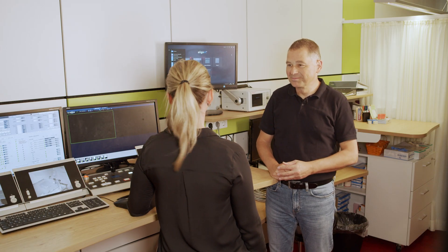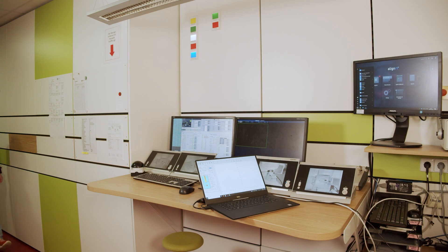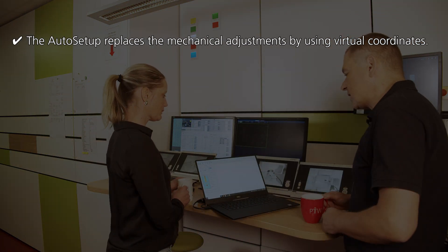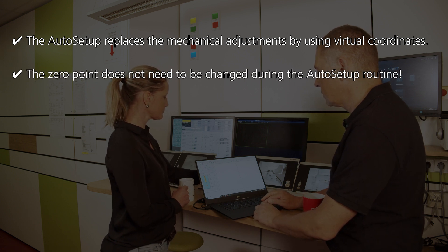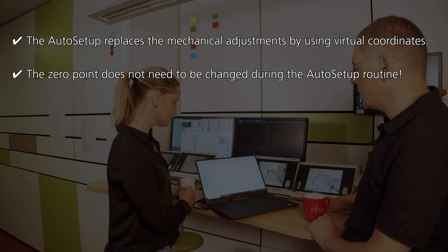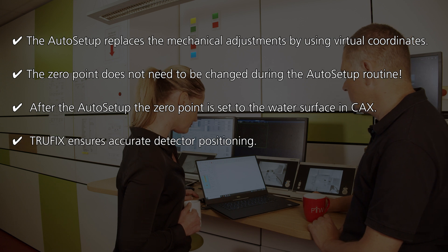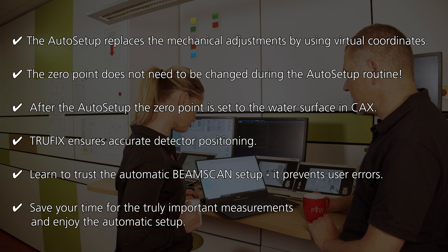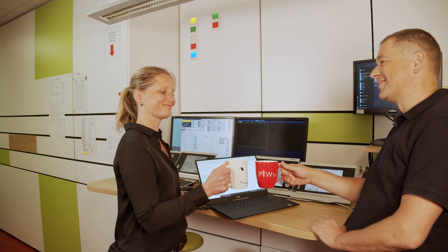Okay, so let's continue. Finally, all these setup features help to get the BeamScan water phantom ready to measure in an impressively short period of time. The auto setup replaces mechanical adjustment using virtual coordinates. The zero point does not need to be changed during the auto setup routine. After the auto setup, the zero point is set to the water surface in central axis. The detector positioning is determined by TruFix. Trust the automatic BeamScan setup — it prevents user errors and saves your time for the really important measurements. And they measured happily ever after.